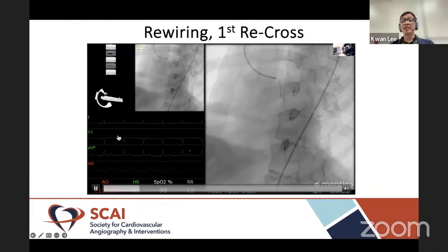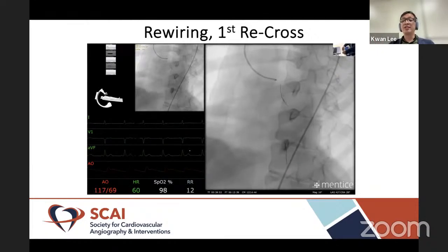So one of the things that the system cannot do is it doesn't simulate the stent struts very well. So whether you cross proximal or distal, you don't really have that much control within the simulator. So that's important to point out. And the consequences of crossing at a different point with regards to resistance to the balloons traversing the thing are not well mapped out. You don't really feel that when this happens.